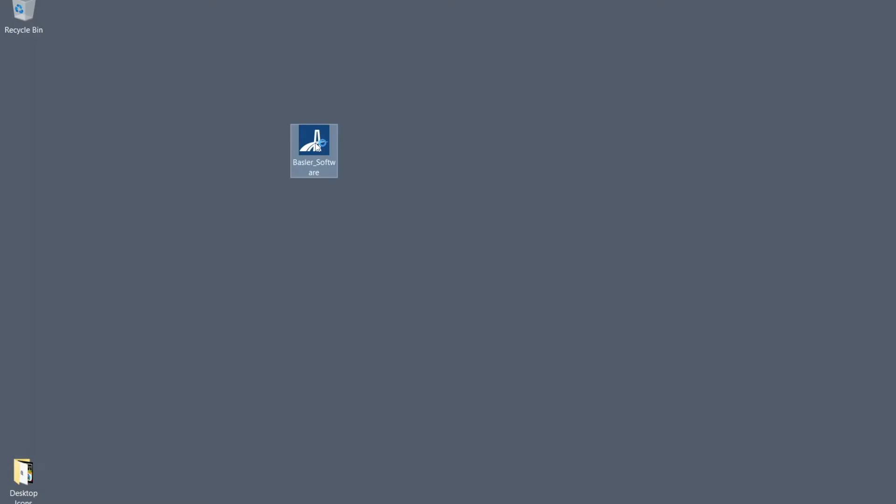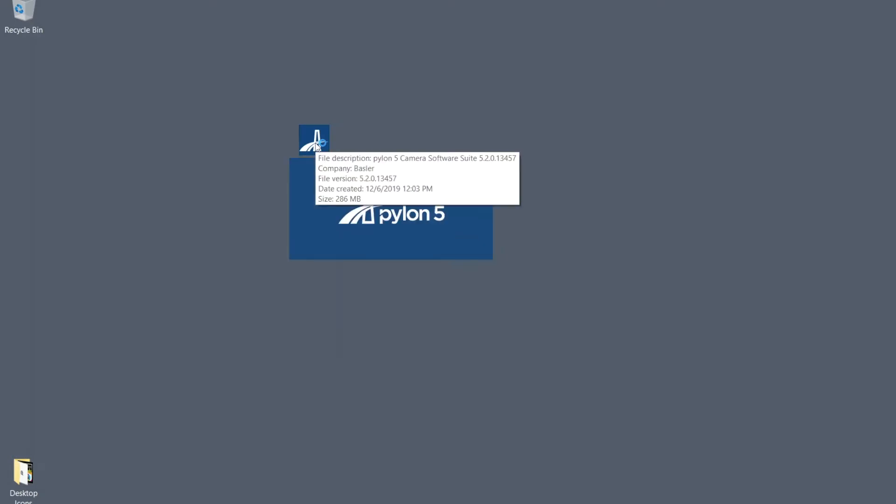After the download is complete, double-click the setup file to install the Pylon software. In this example, the setup file was downloaded to the desktop.